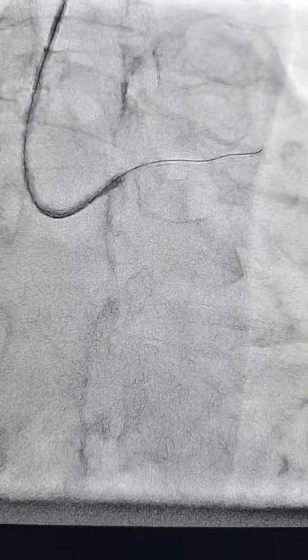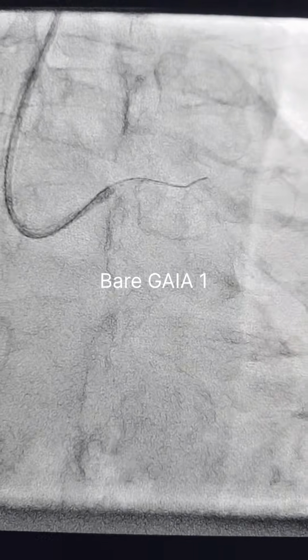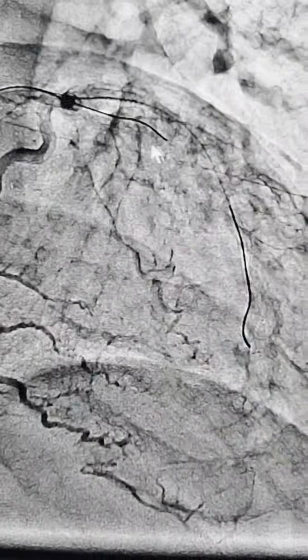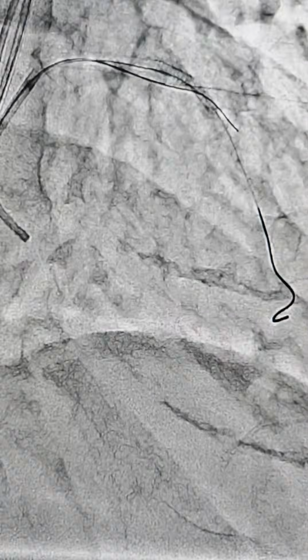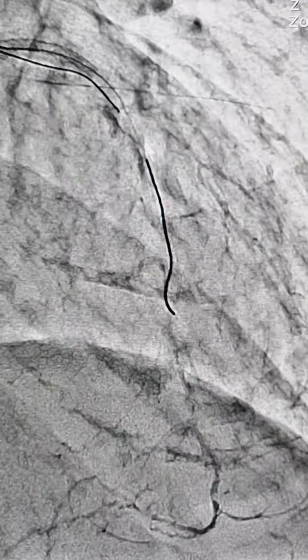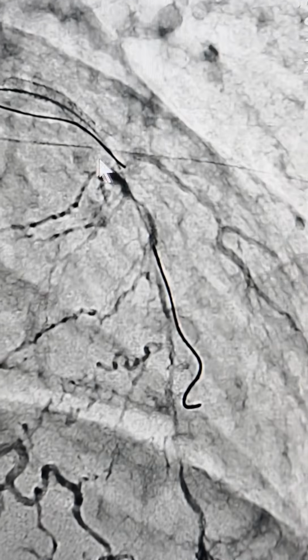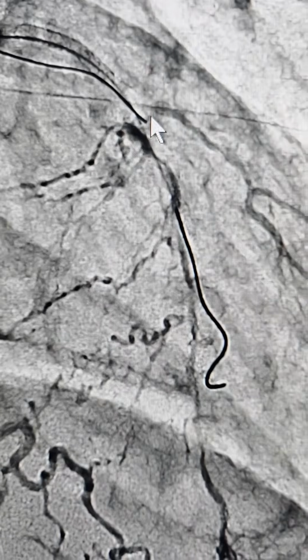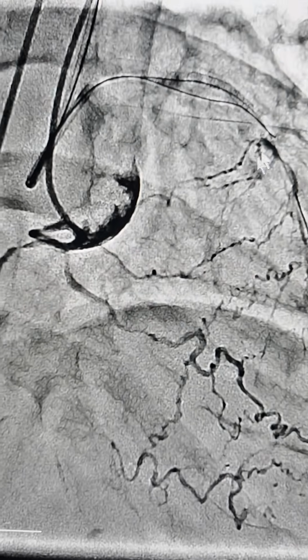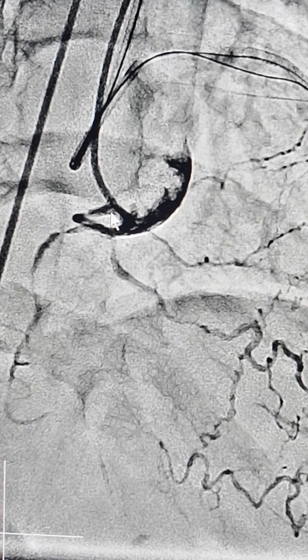This is our LAD attempt. Went in with a Gaia 1 which crossed easily, but then in the mid area I could not see where it was going. So then we punctured the left side, and as you can see there is this LAD, and this is a bend here, a 90-degree bend, and this is the diagonal, and you can see that this was filling through a conus branch.